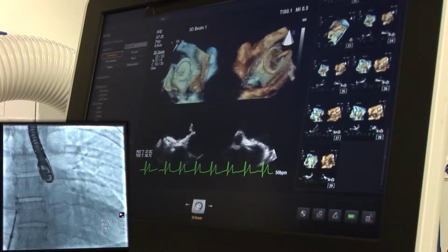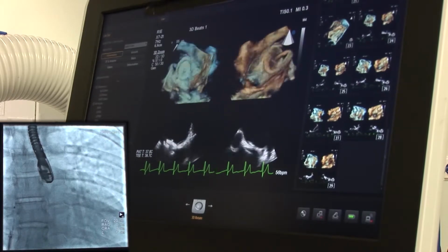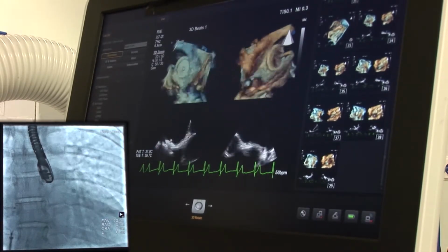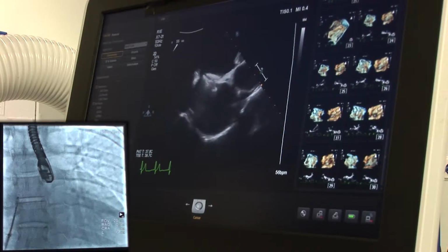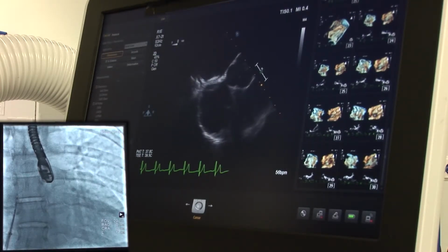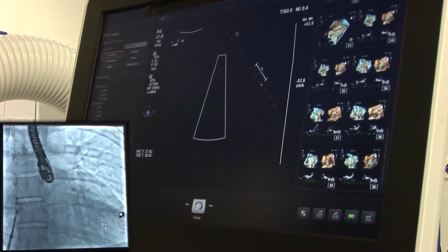We'll see what Nilesh thinks, and I specifically want to have a close look at the aorta in this case, because I think this PFO is quite close to the aortic root, which it often is, and we just like to be reassured that the device isn't touching any part of the aortic root. And Nilesh should also have a look at that eustachian valve that was very prominent. Over to you.